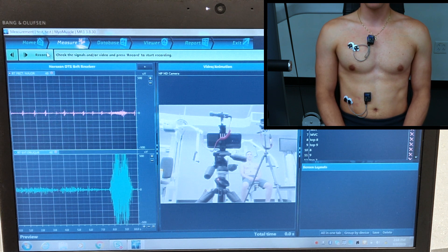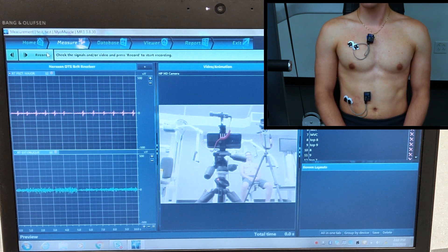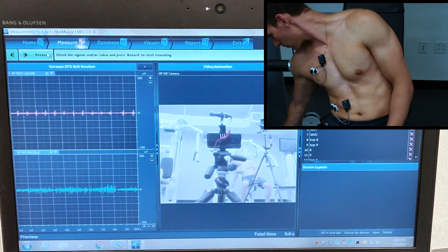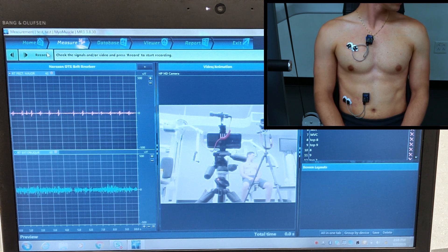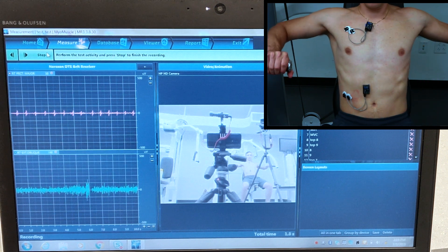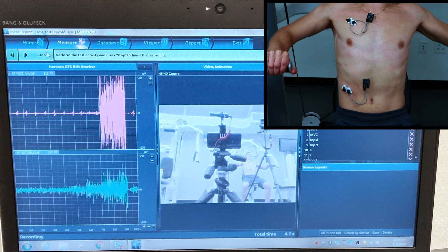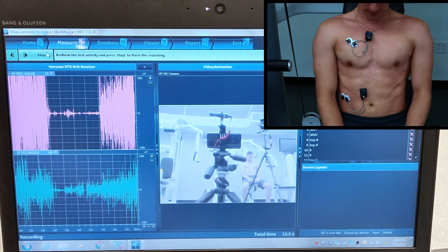Now that those are confirmed and working properly, we can get started with our marker sets. The first thing we have to do is record an MVC — a maximal voluntary contraction. This is going to be a maximal contraction, as hard as possible, and it will give us a reference for the rest of our EMG recordings. So we'll say we're starting in 3, 2, 1, hit Record and have our subject perform the MVC. Keep going as hard as you can — done. Then we'll hit Stop.